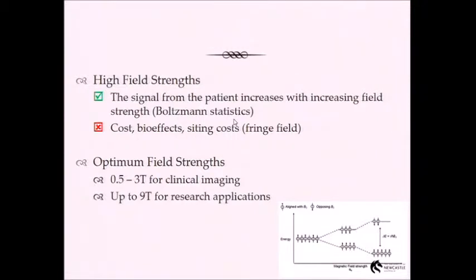The manufacturers have hard set parameters in there that you cannot bypass. When you scan in MR, you normally talk about 3 modes: normal mode, first level and second level. Normal mode is if I want to scan anyone, I'm normally operating in normal mode. If I get a complaint from the scanner that says the paradigm I've set up is going to go beyond a certain level, it will ask me if I am willing to push the parameters to first level? And for the majority of people that you scan, the answer is yes.